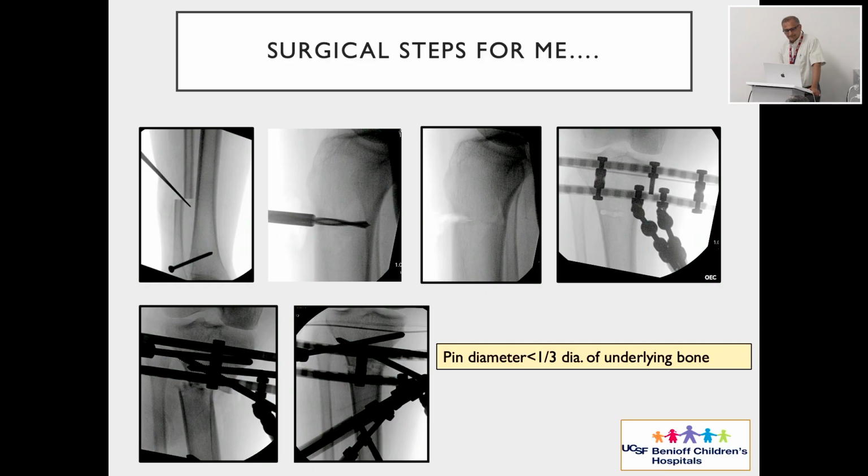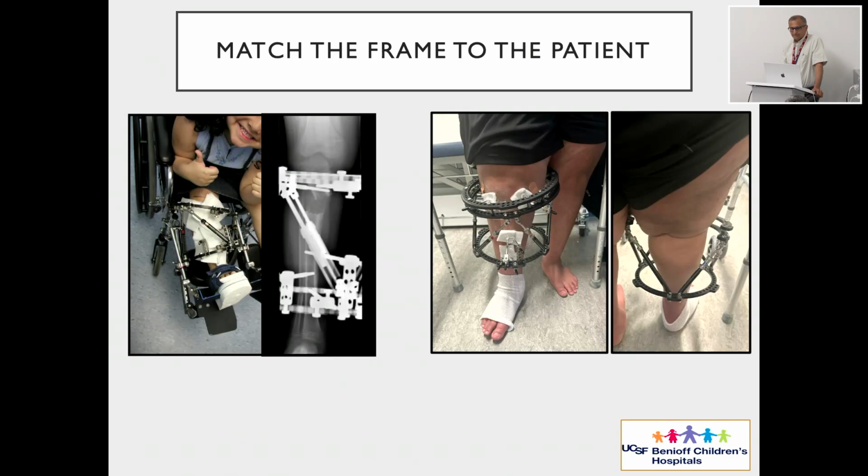The one thing I must say, and I've done this multiple times, is where you think the bone's broken and it's not, because it's just rotating. So you have to convince yourself by translating and making sure the bone's totally broken so that, if you're doing a gradual correction, it's not incomplete and you have to go back.